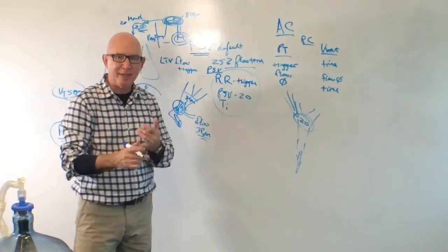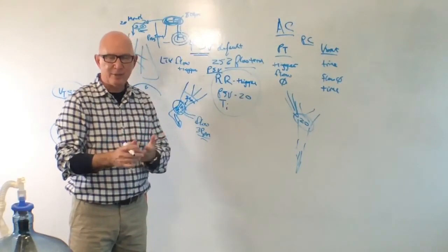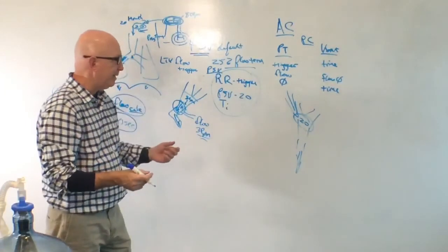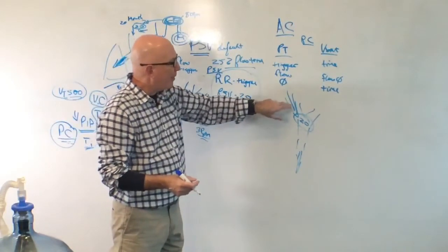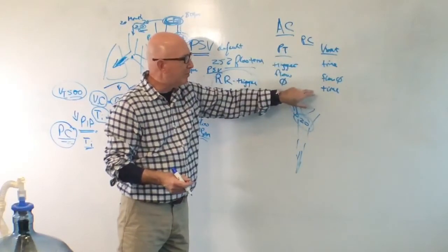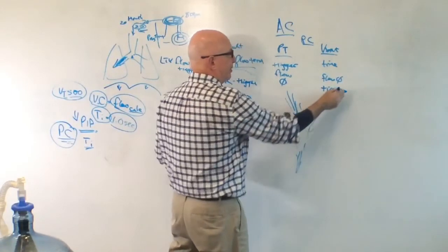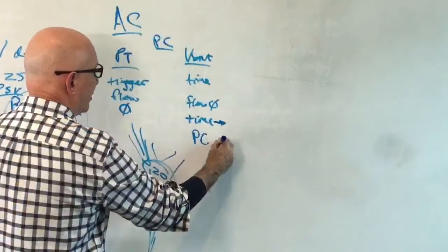It can result in hypercapnia, it can result in more anxiety on the patient's case. It can result in more barotrauma as well, and at the end of the day, none of those things are good for the patient, and are uncomfortable for them as well. So there is a way to try to tailor a pressure control breath more to what the patient wants. And some of you may actually be familiar with this. In the background menu, you can turn something on which is called pressure control termination.